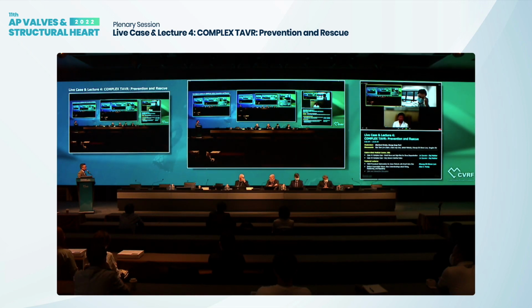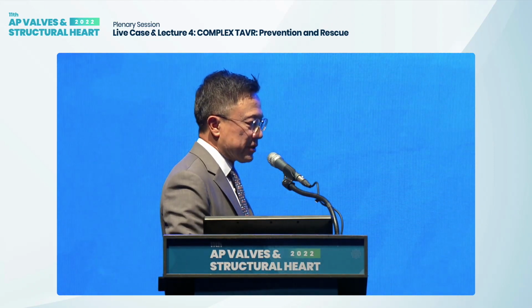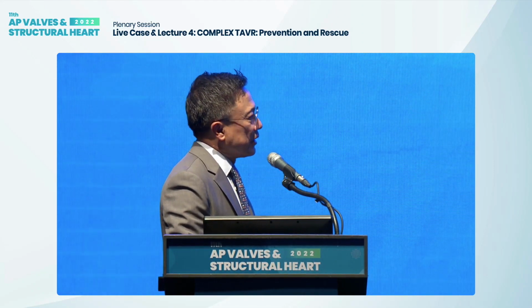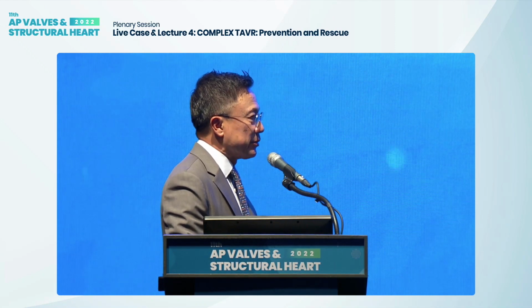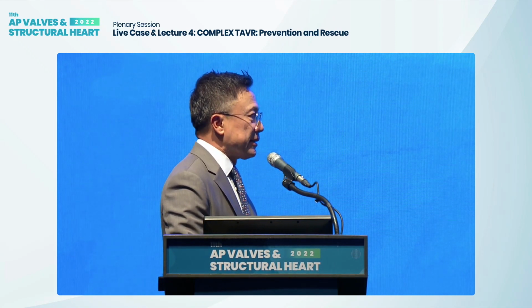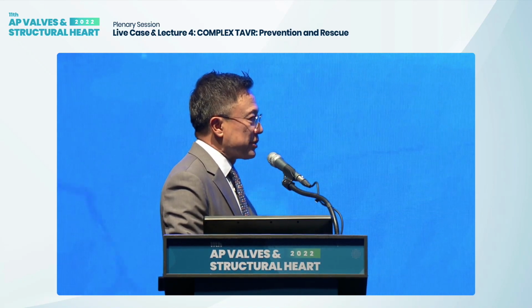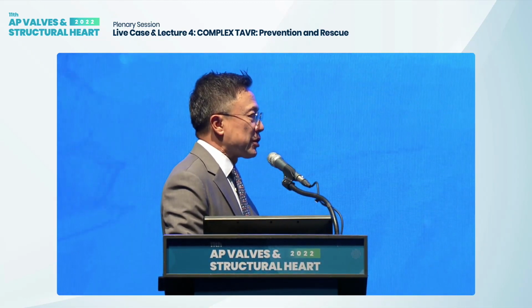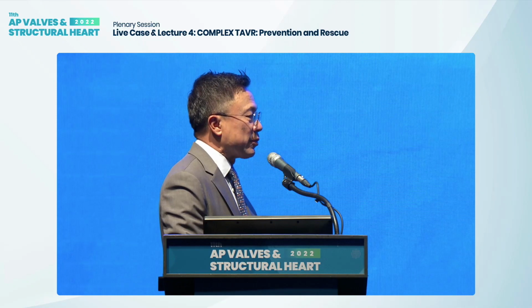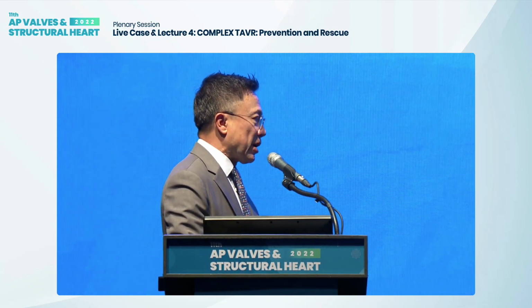So actually, as you know, the shockwave was sort of worked out as a system at Stanford's valve design group, and one of the early thoughts was to have a balloon that can do balloon valvuloplasty without implanting a stent by cracking the calcium more consistently. So that potentially could be one way to test whether you can make a valve much better in terms of ability to expand a valve without causing injury. Can it be standalone? I think all that is still possible.